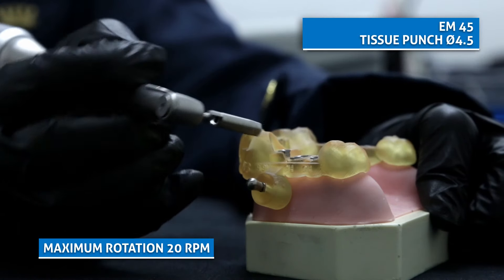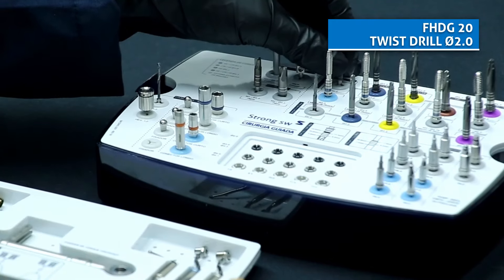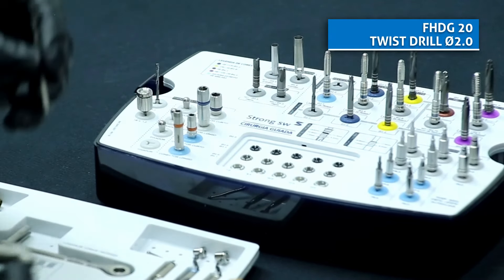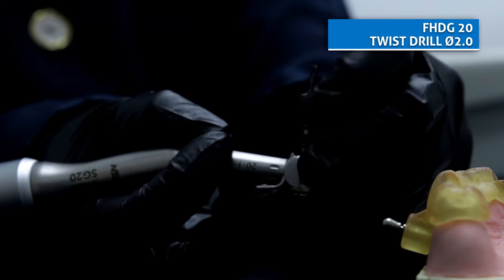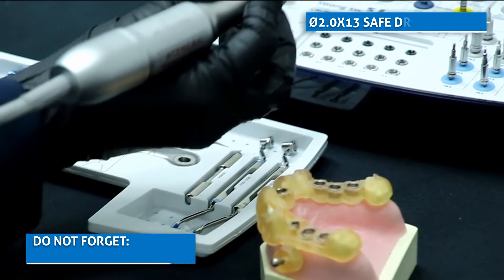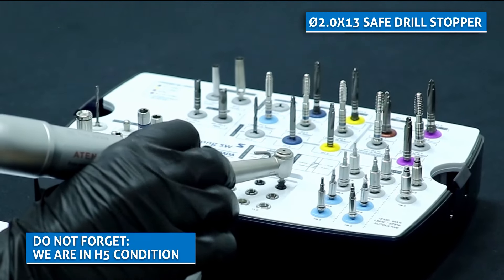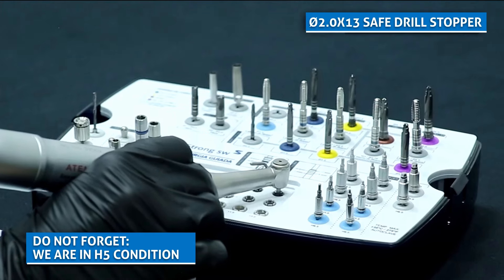After the mucosa has been removed, start the drilling sequence with the twist drill. In this case, we are using the long drill to fit the chosen safe drill of 13mm. Keep in mind that we are in condition H5 and the perforation must be equal to the length of the implant.